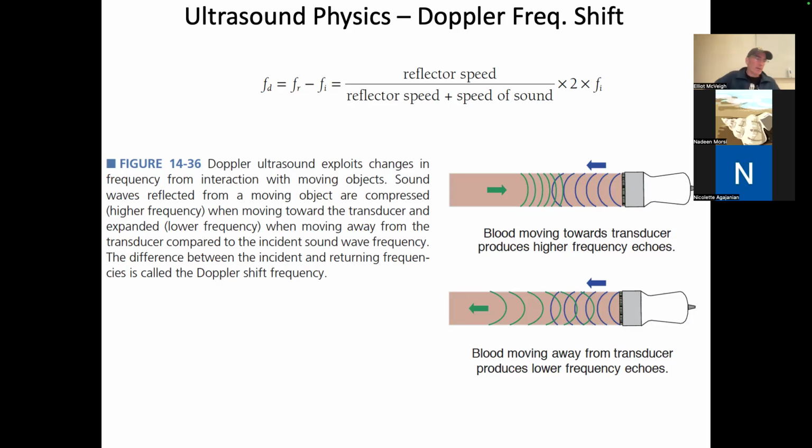So we're gonna pick up where we left off on Monday, which was looking at echocardiography using Doppler. And this is primarily used to measure the blood flow velocity. And as you can imagine, it's very useful to be able to measure the blood flow velocity if, for instance, you have valves that you're trying to determine if they are doing their job, and the blood flow is not getting through the valve when it's closed.